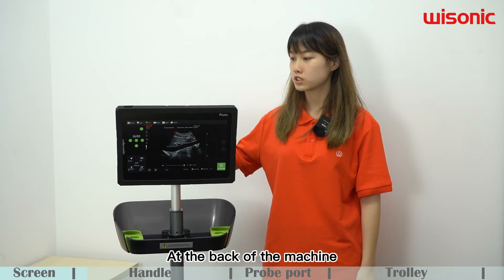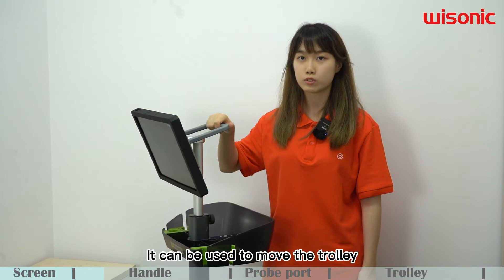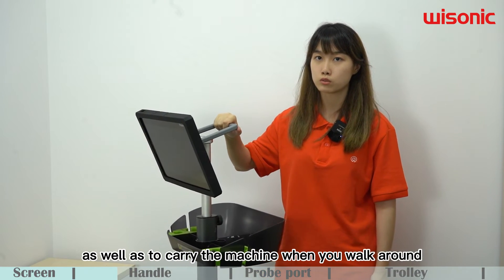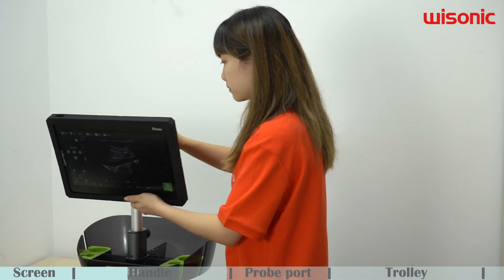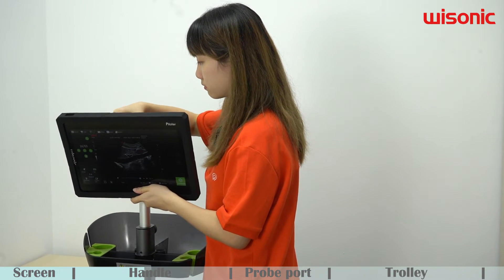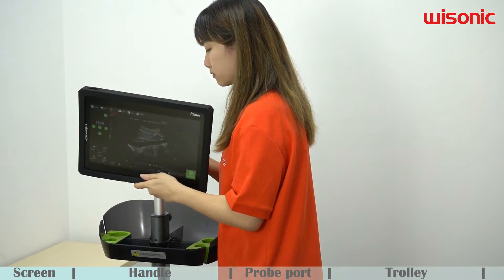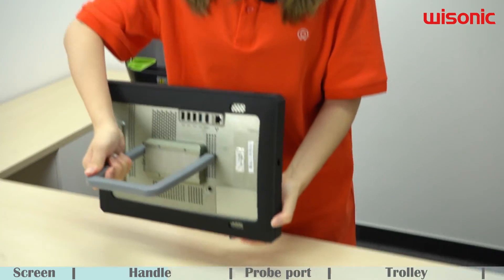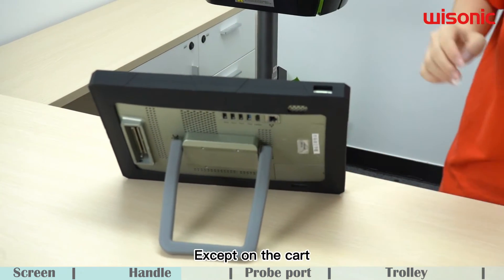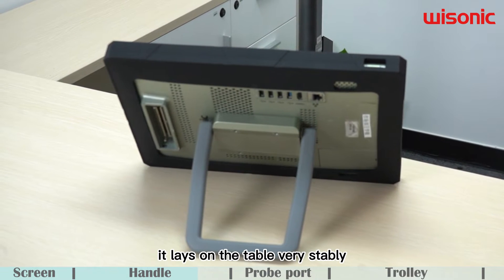At the back of the machine, it integrates a practical 3-in-1 handle. It can be used to move the trolley as well as to carry the machine when you walk around. If set on a car, by rotating the handle, it sits on the table very stably.